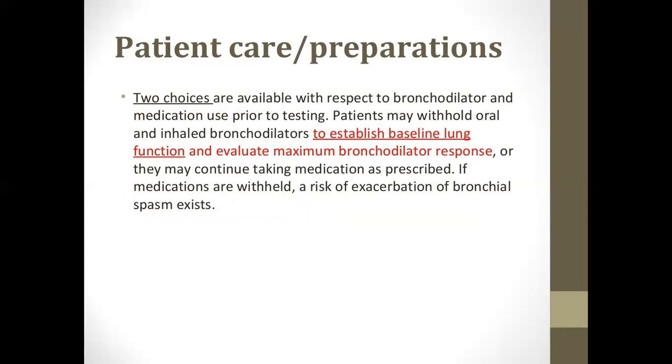Patient care and preparations. Two choices are available with respect to bronchodilators and medication use prior to testing.